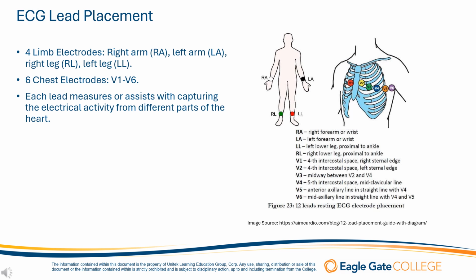Each of these leads measures or assists with capturing electrical activity from different parts of the heart. By correctly placing these electrodes, we can ensure that we get a comprehensive view of the heart's electrical activity from multiple angles. This allows us to identify abnormalities and make accurate diagnoses.